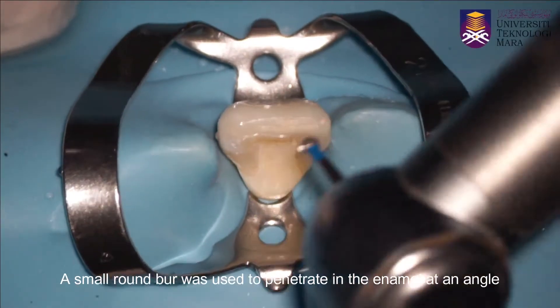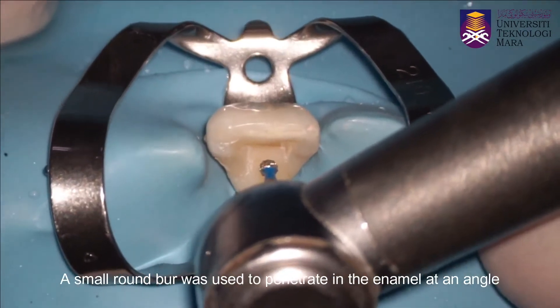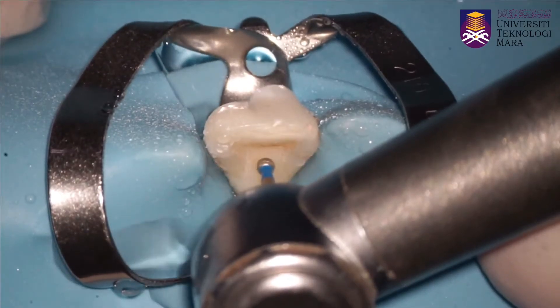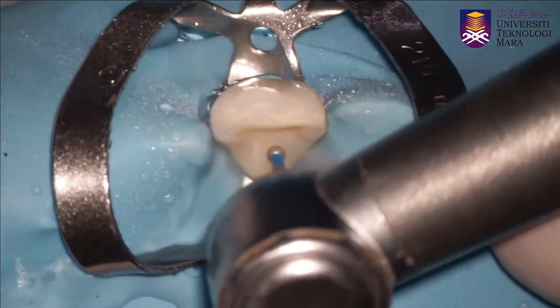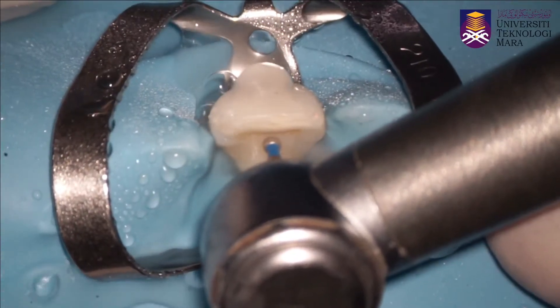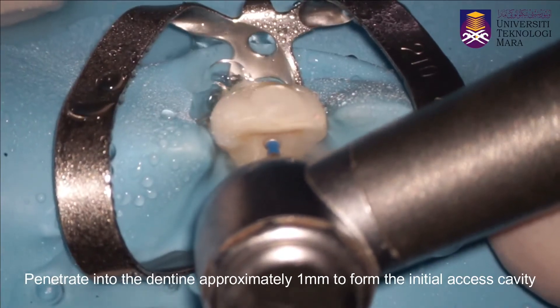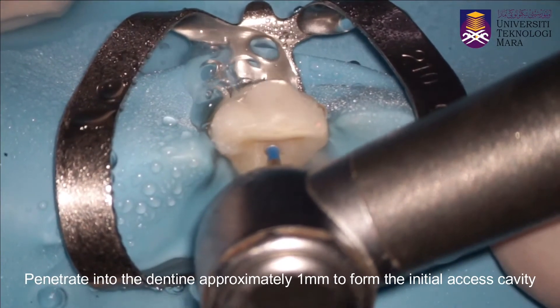A small round burr is used to penetrate into the enamel at an angle perpendicular to the surface of the tooth. Penetrate into the dentin approximately 1 mm to form the initial access cavity.